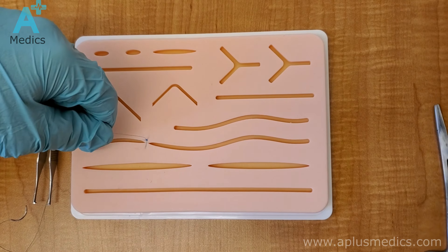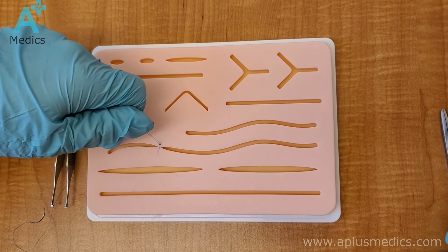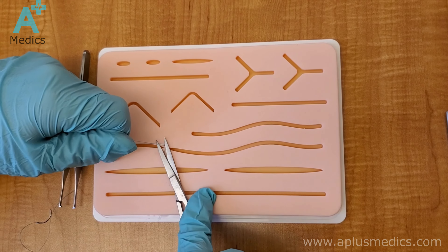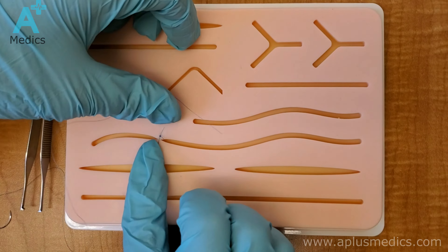Grab the scissors from the package and then you can cut the string. The way to cut once you have the strings in your hand is to angulate a little bit once you get the scissors in — angulate a little bit because that will give you some room so that you don't cut the strings too short.